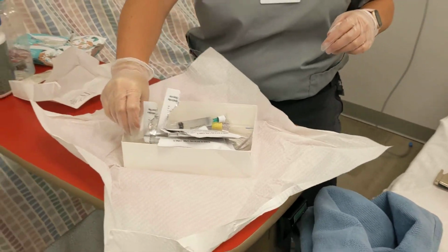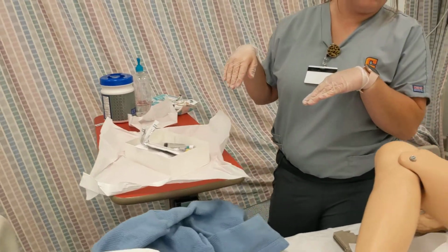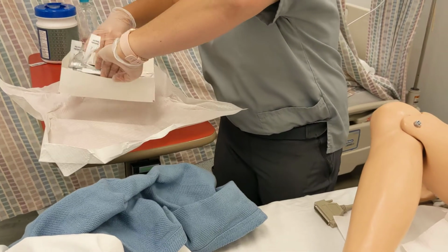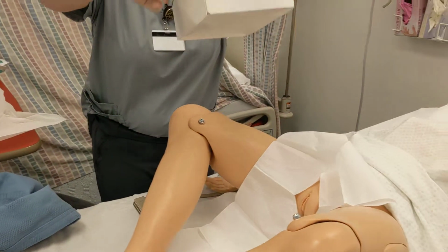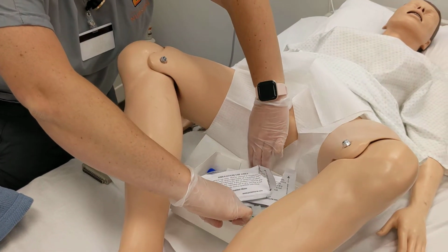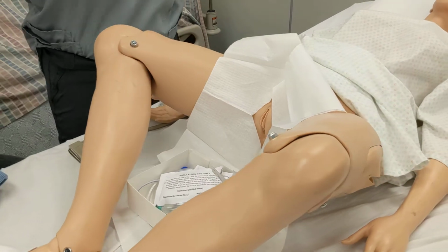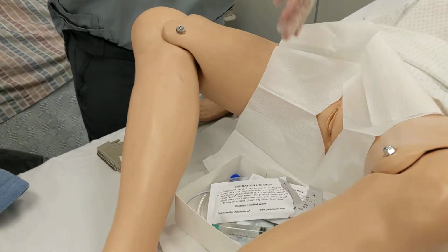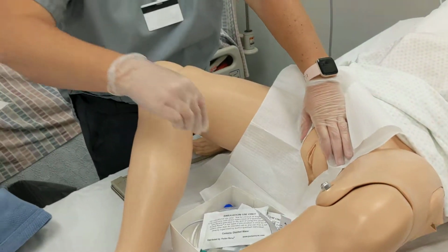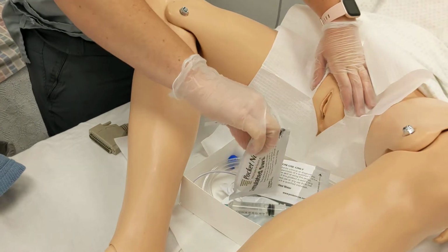Okay, so now I'm going to transport this over to the patient between the legs. Okay, so now I am going to put my hand right here, and this hand is now contaminated. Let's get my swabs out.